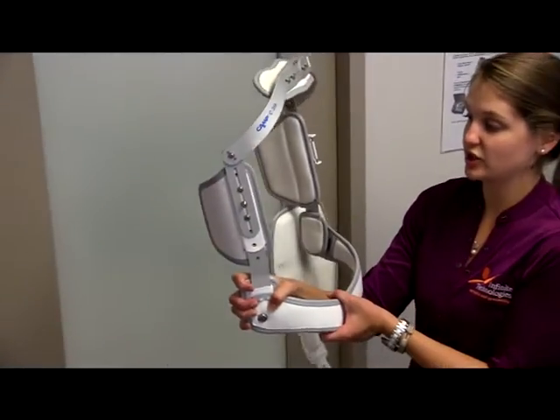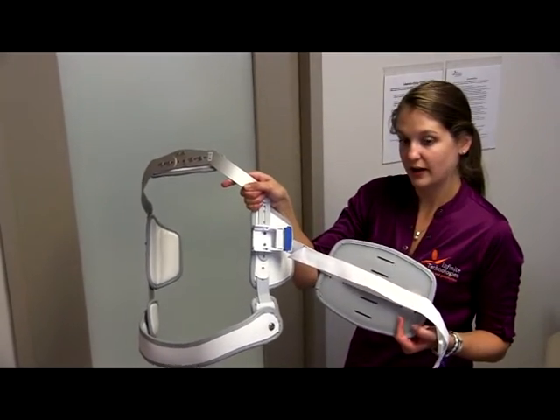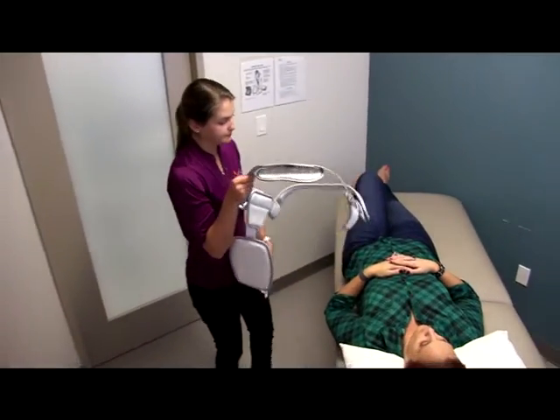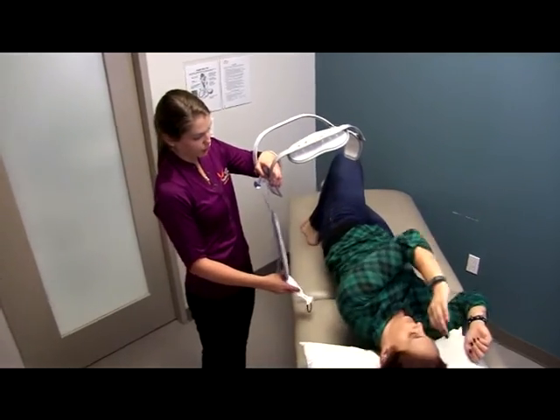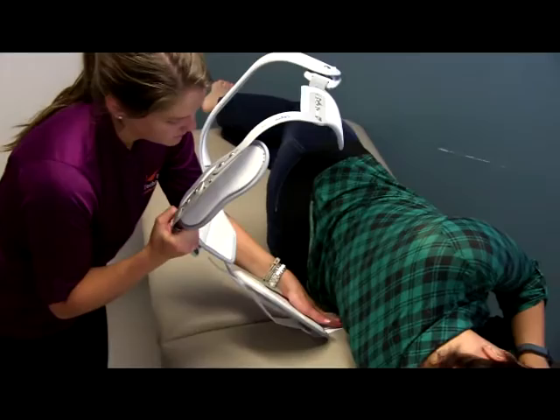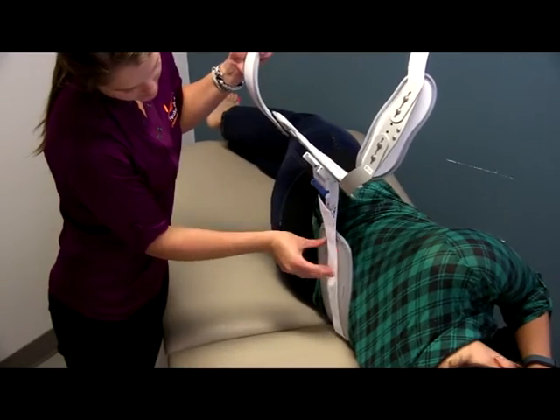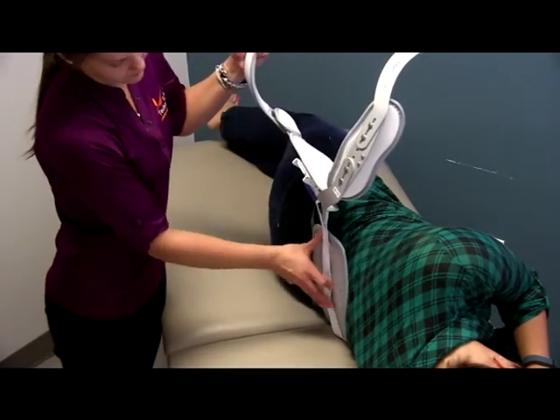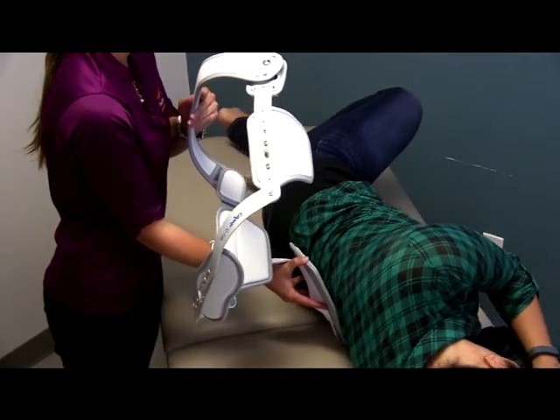Once we have the strap detached, it will still be attached on one side. So now we're going to go ahead and fit the patient with this. She's going to roll away from me and I'm going to push the strap underneath her — at the waist level is going to be the easiest place to push this underneath. The back pad is going to get placed in the middle of her back, right at the apex of the arch of the curve of her back. Then have her roll back on top of the pad while you hold the pad in place.